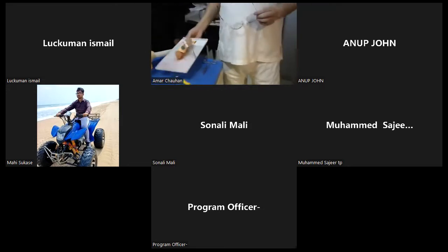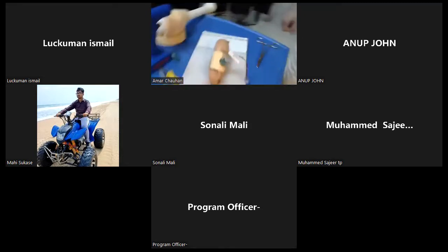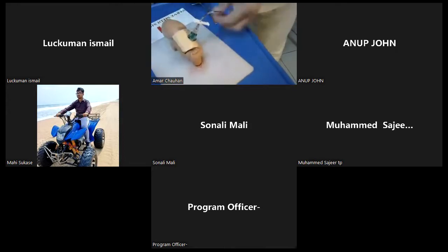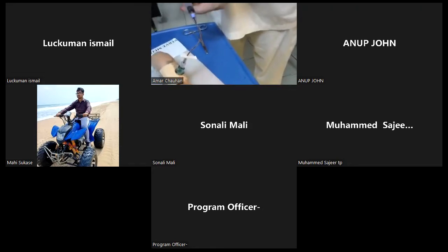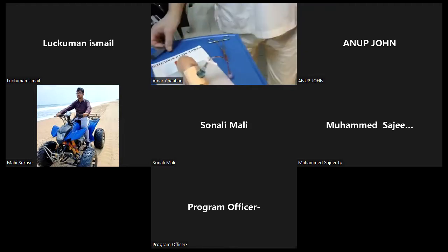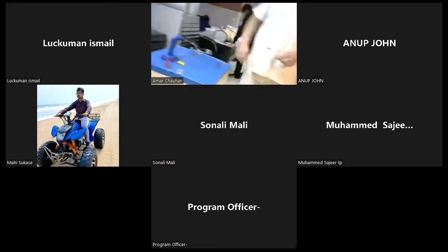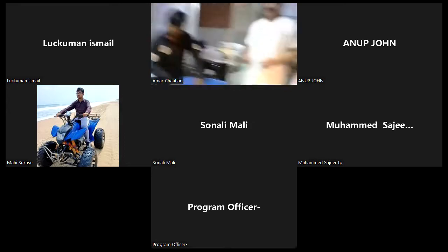I'm not able to see it in between. Some breakage is there. Yeah, okay, mounted. And now we'll show focus. Okay. Do you want to see the aspiration of blood, Dr. Ajit? The shoulder trainer you have already shown. Okay, yes. Deep wound for packing. Stop the bleed trainer. Okay, sir. We will show. Hello. Just look back.